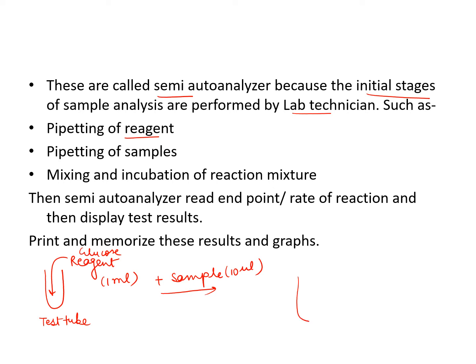So this is the test tube. In this is the reagent, and we are adding this. See, this is the sample or patient serum. Okay, then what will happen? This pipetting of reagent is done by the lab technician. Pipetting of samples is done by the lab technician. Then we will mix it. Reagent and sample, there will be a mixing of reagent and sample, and then incubation.